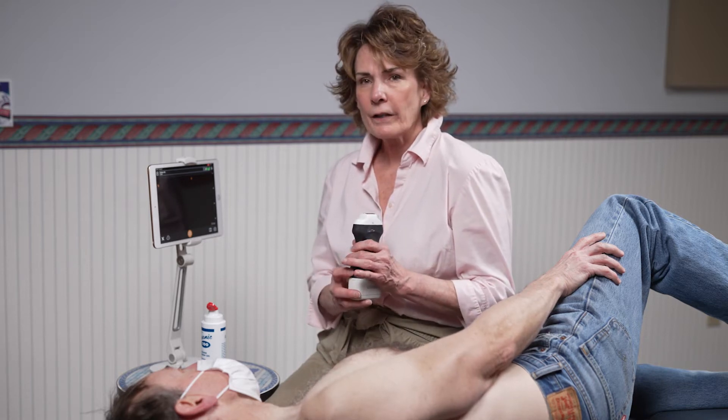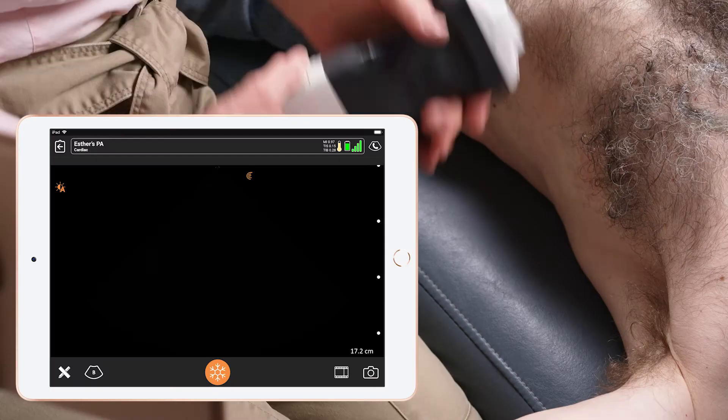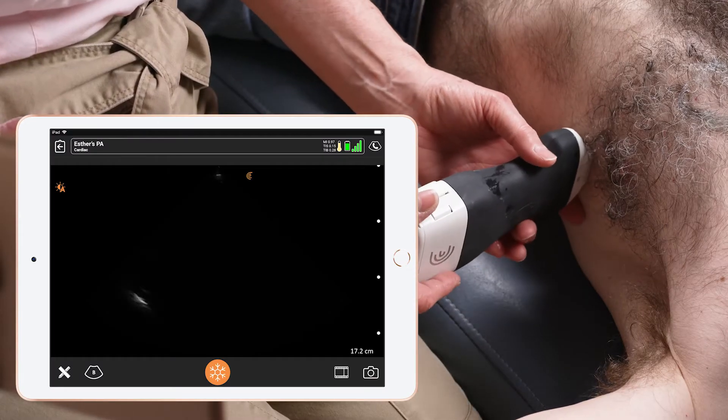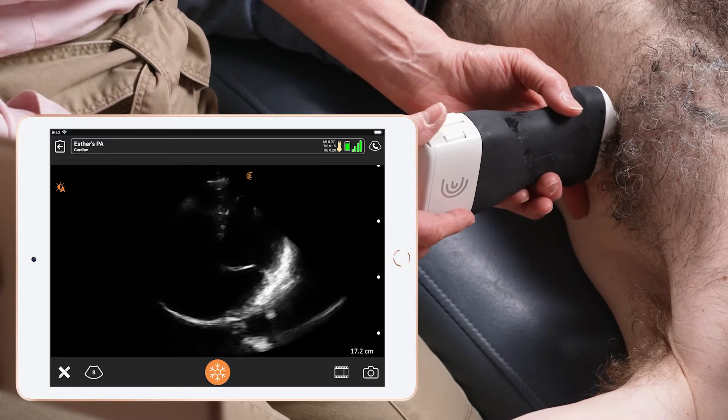I'm going to have the indicator on the scanner towards the patient's left side, and I'm looking to elongate the left ventricle and the right ventricle to their longest length.